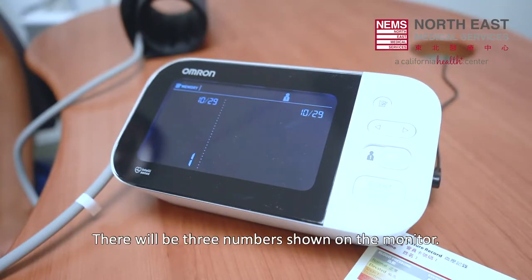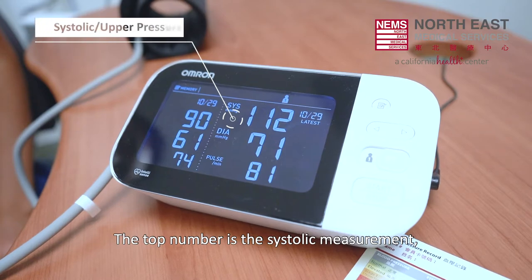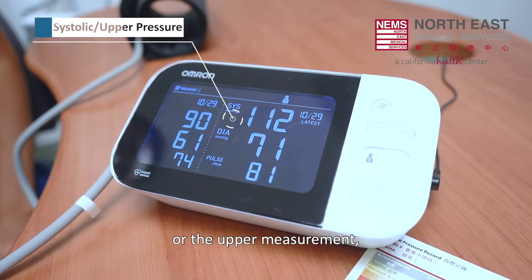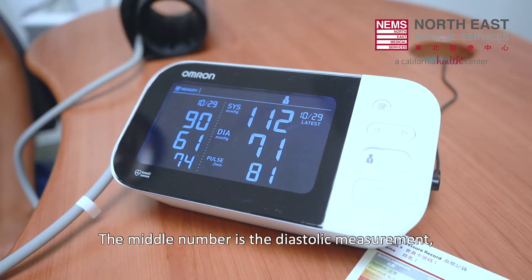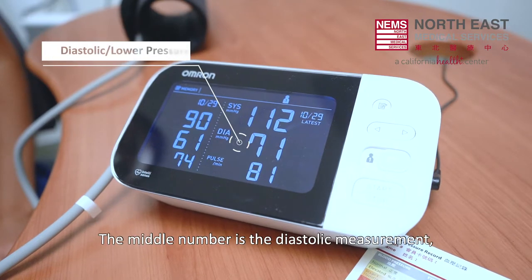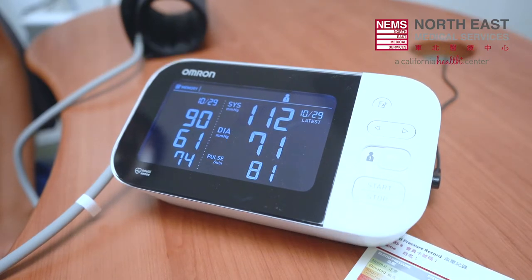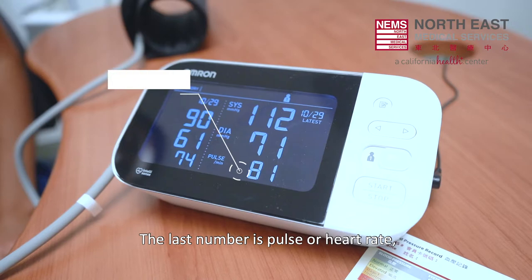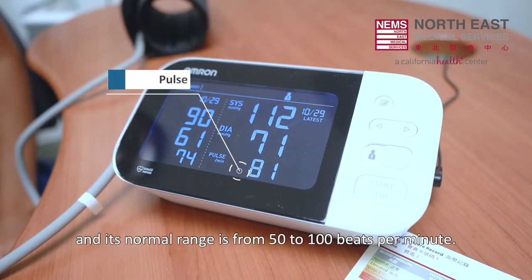There will be 3 numbers shown on the monitor. The top number is the systolic measurement, or the upper measurement — the normal range is 100 to 120. The middle number is the diastolic measurement, or the lower measurement — the normal range is less than 80. The last number is pulse or heart rate, with a normal range of 50 to 100 beats per minute.